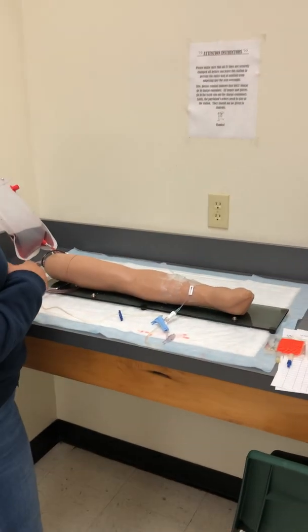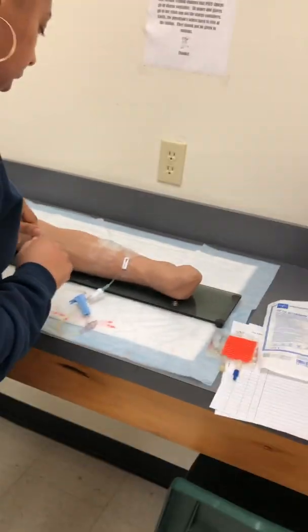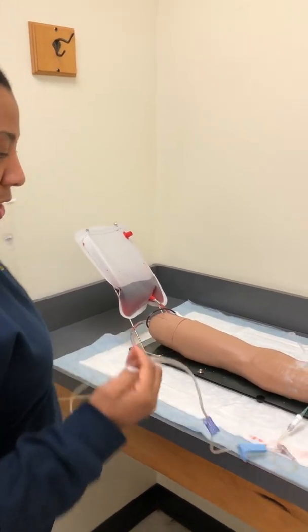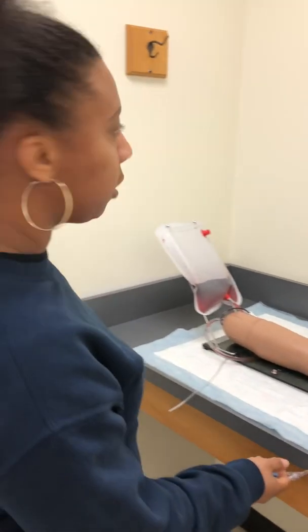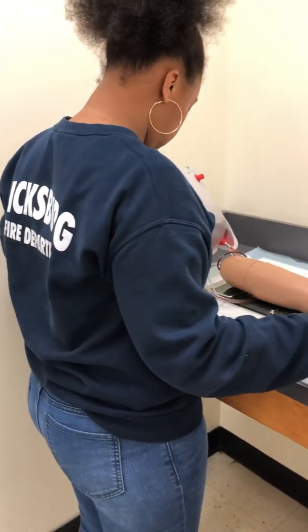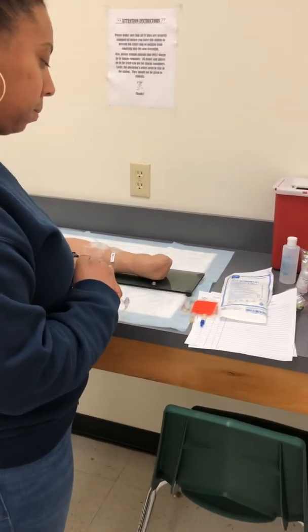I'm going to look at my patient's IV site, check for any signs of infiltration, check for any redness, tenderness, any drainage, any swelling. So I don't see any of that. I would then lower my primary fluid just to see if I get good blood return. That also lets me know that it's patent. So I got good blood return. So that IV site is still patent. All right. I would go ahead and do hand hygiene again.